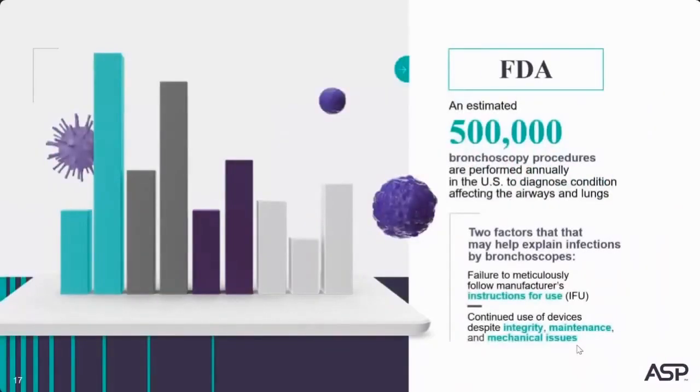In 2015, the FDA estimated 500,000 patients receiving bronchoscopes for diagnosis of conditions affecting the airways and lungs. I suspect that number has gone up in 2020, especially with all the respiratory symptoms associated with COVID-19. The FDA also identified two factors that can contribute to infections associated with bronchoscopes. One, not meticulously following manufacturer's instructions for use, and two, using devices that are damaged.